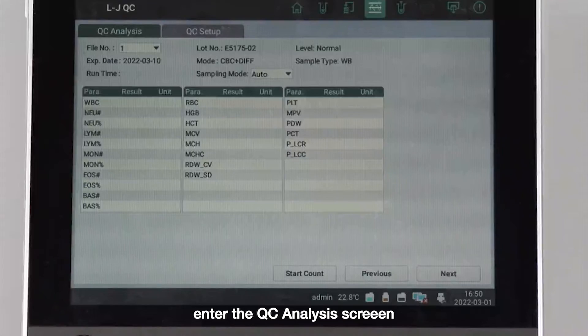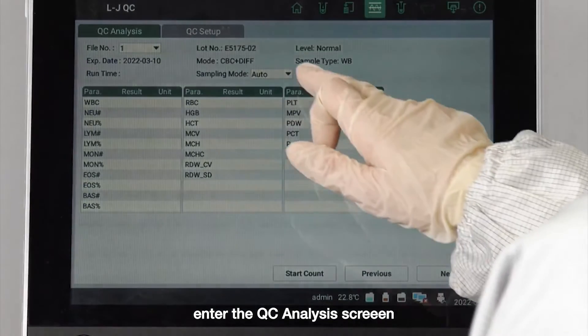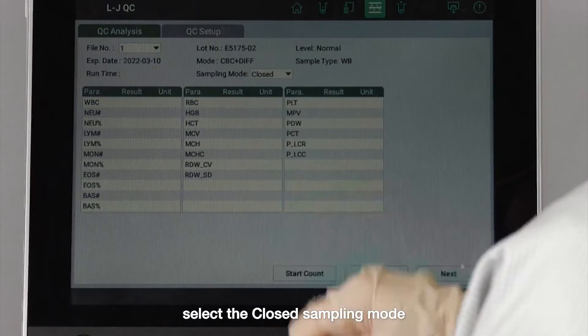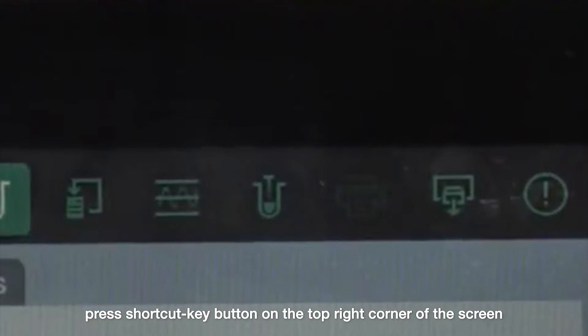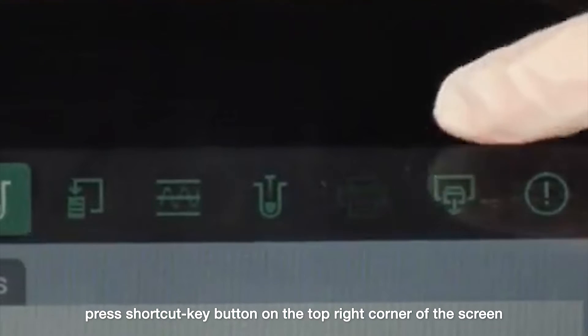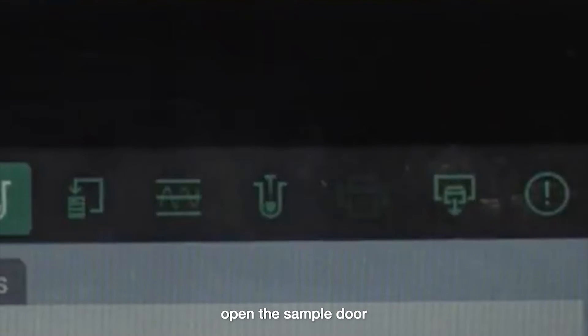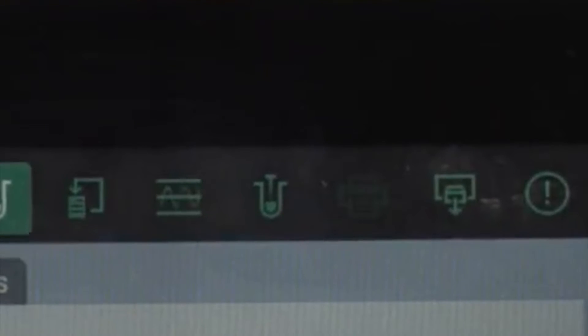Enter the Quality Control Analysis screen. Select the Closed Sampling mode. Press the Shortcut key button on the top right corner of the screen. Open the sample door.